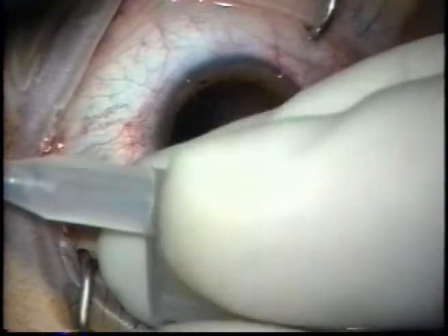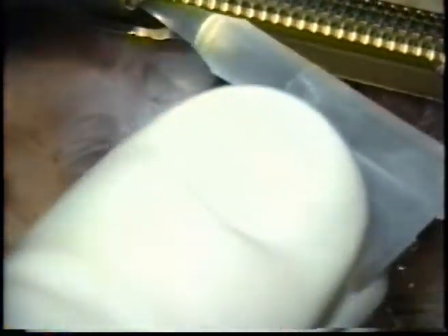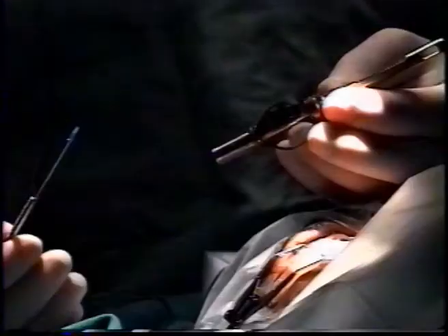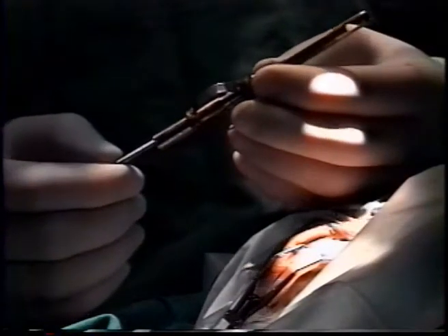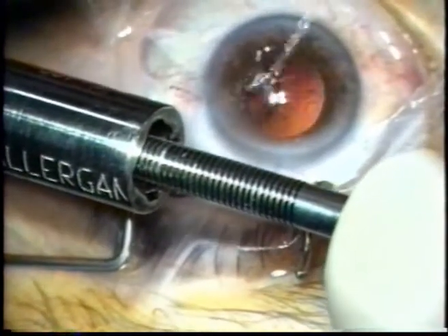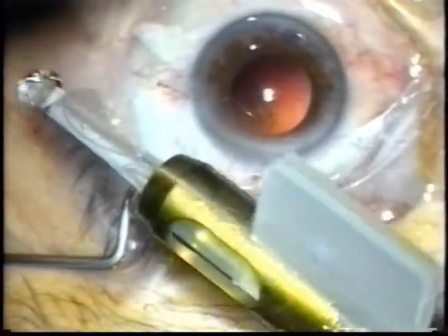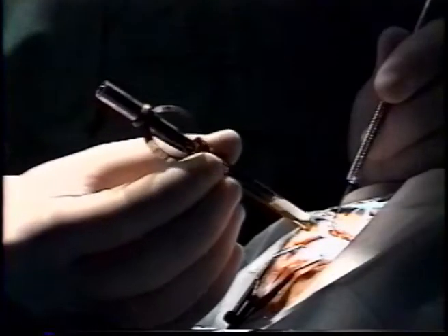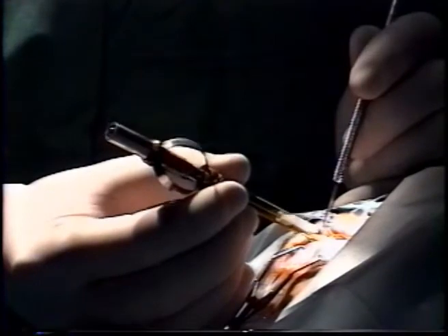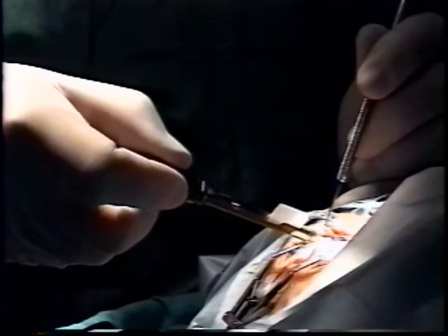The loading procedure consists of first loading the cartridge with the IOL and inserting it into the injector body in standard fashion, then attaching the silicone tip to the plunger. The plunger is inserted from the rear end of the injector body, engaging the IOL and pushing it to the tip of the cartridge. The plunger length was calculated to allow a quick loading procedure, leaving the leading haptic almost emerging at the cartridge tip and ready for implantation. The implantation procedure starts with the insertion of the injector tip into the eye, with IOL ejection carried out by repeated pressure cycles exerted by the operator's fingers over the grasping area.